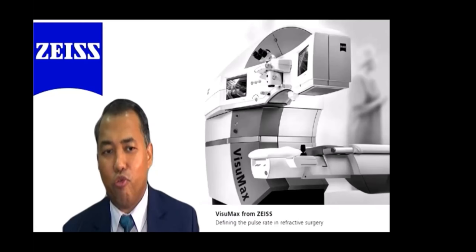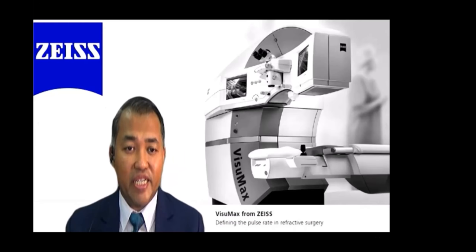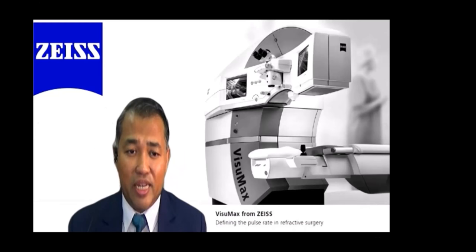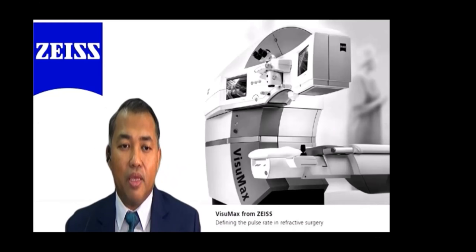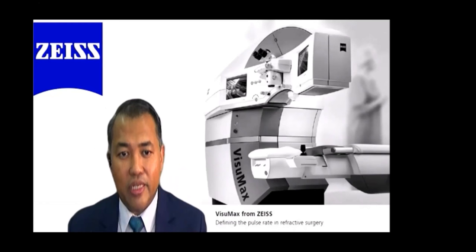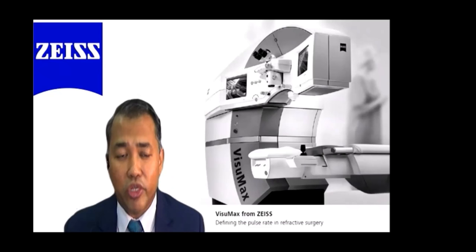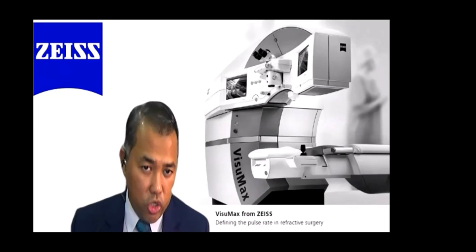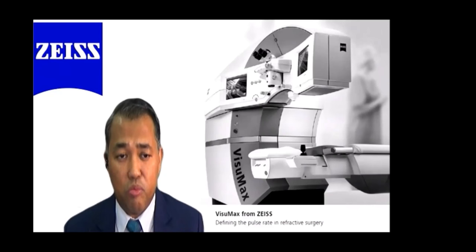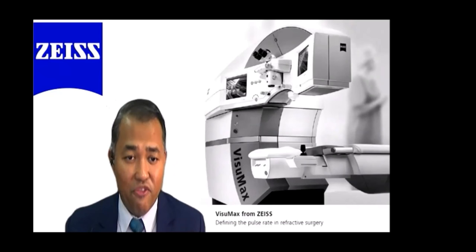This indeed is a very interesting question. Usually, to explain it in simple terms, I would compare the SMILE procedure to a laparoscopic procedure in general surgery. SMILE is a keyhole procedure that attempts to achieve the same goal as conventional LASIK or PRK. There are obvious advantages structurally when you perform a small incision procedure. At the same time, the precaution, indication, and safety margin will remain the same. There are definite advantages and disadvantages with small incision surgery. To the patient, I would still advise them to take necessary precautions and counsel them like any other laser refractive surgery modality. To my colleagues, I would advise them not to venture outside the safety margin, though SMILE has the definite structural stability advantage when compared to LASIK.